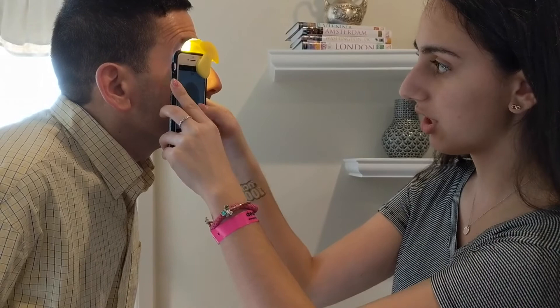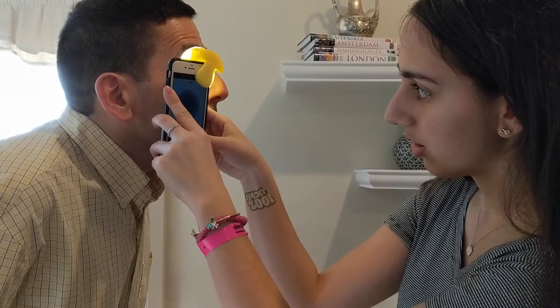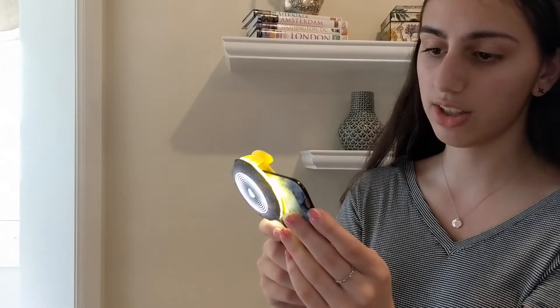I'm going to go right up to his eye so I can capture an image of his cornea. I'll tap on my phone to try to focus it and make it brighter so I can capture the image. Sometimes this might take a while to focus it. And then I have a captured image, which you can see here, with all the different rings on it.